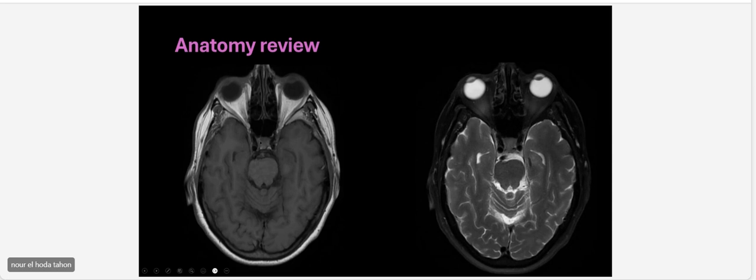And here, this structure is also very important. So again, this is the fluid. So this part of the internal carotid artery bilaterally, okay, it's like a cavernous portion. And this part is the tip of the basilar artery. And here is the prepontine cistern. So all of this CSF, okay, and it's connected together. And you can see here also this ambient cistern is part of the basal cisterns here.